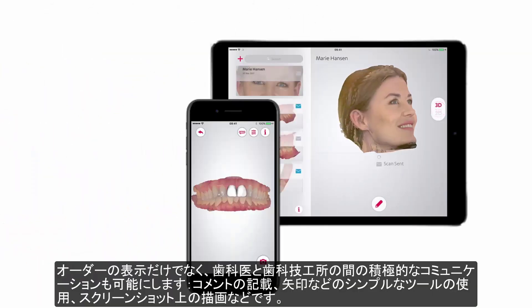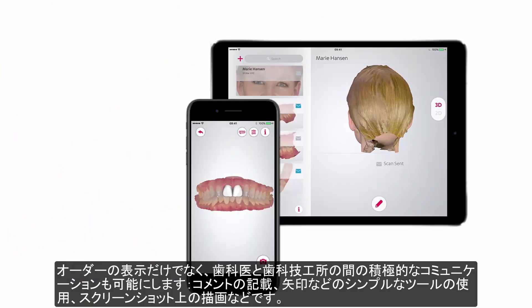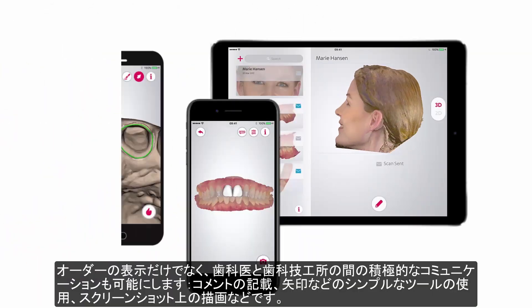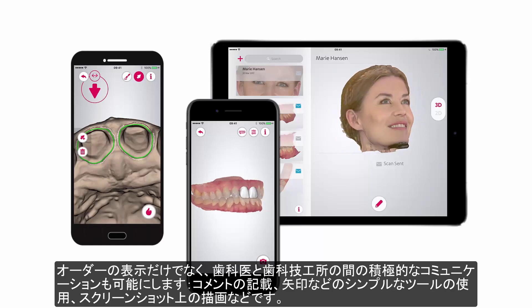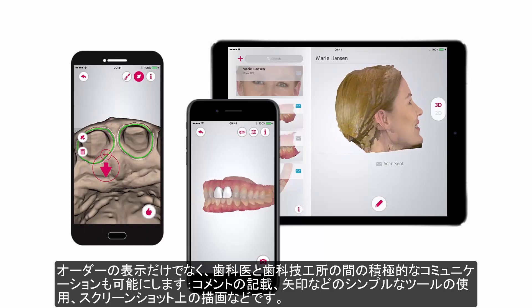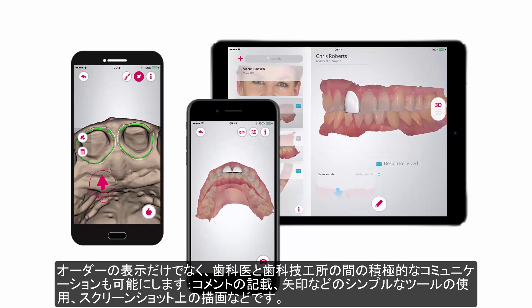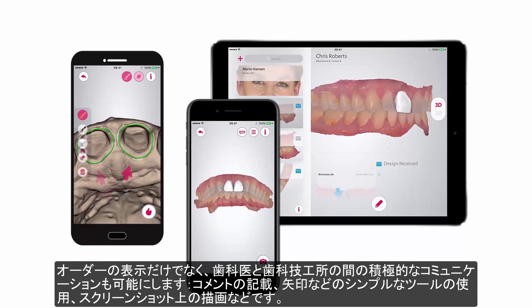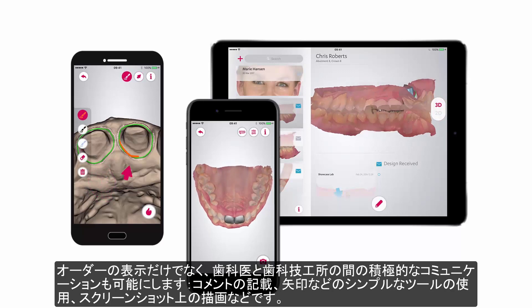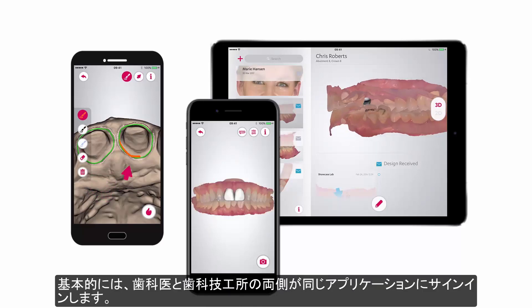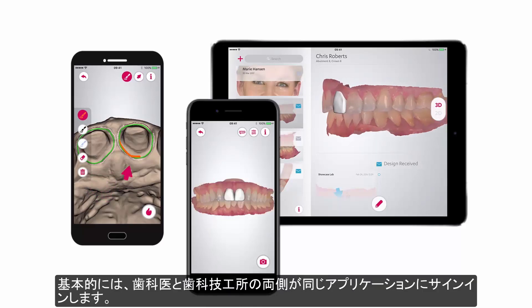It enables not only the viewing of cases, but also the active communication between a dentist and a lab — writing comments, using simple tools like arrows or drawing over a screenshot. Both dentists and labs sign in to the same application.